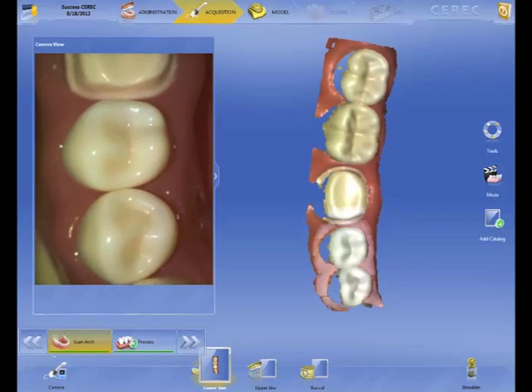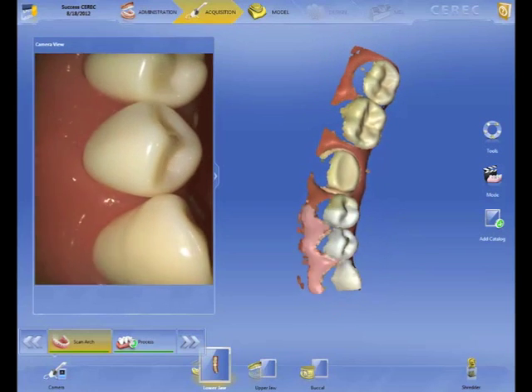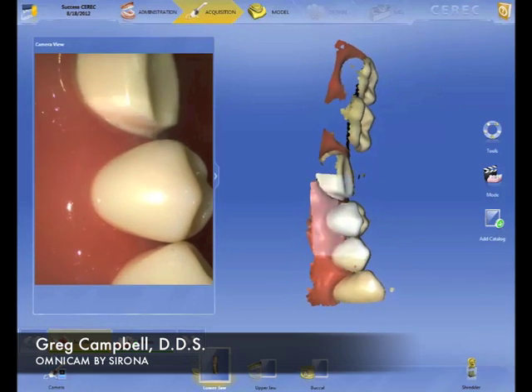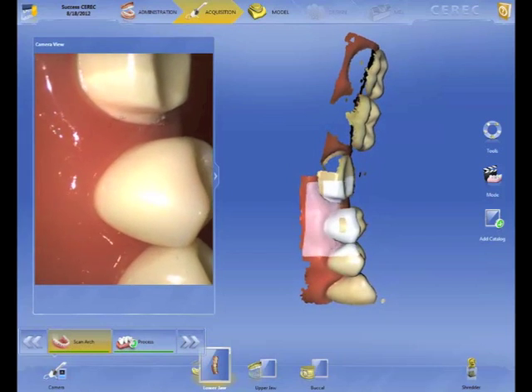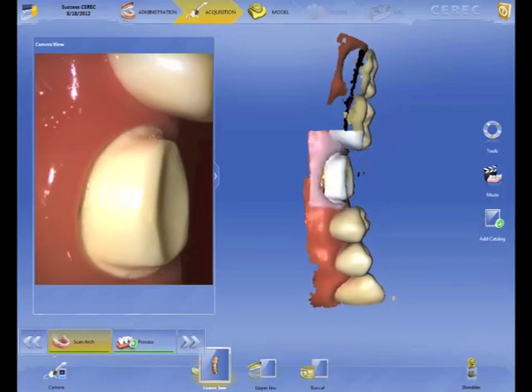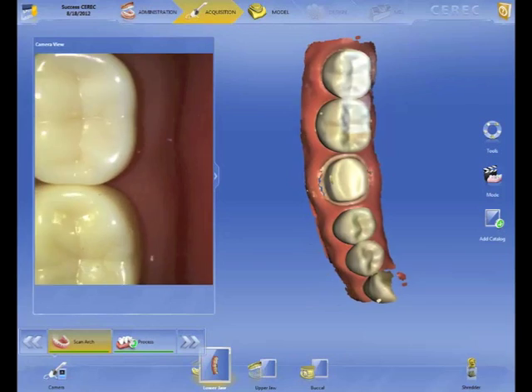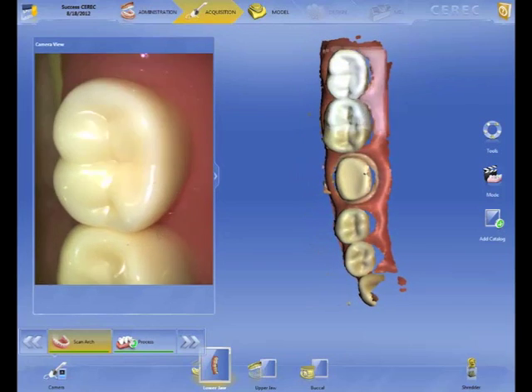I'm really impressed with how this is going. What we're doing here is looking at how we want to image. There's no wrong way to do it. You don't have to image post to post. You want to pitch and roll this so you can capture all the data, so you have color streaming video of the entire arch.